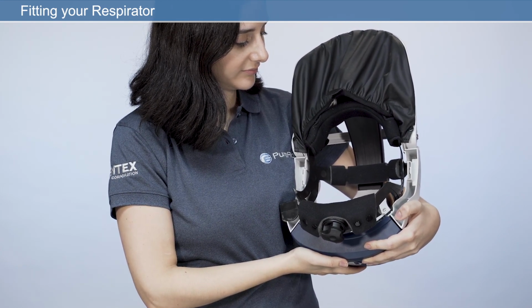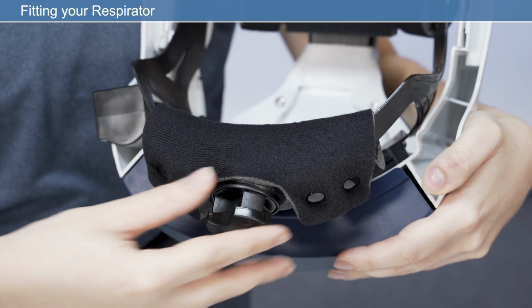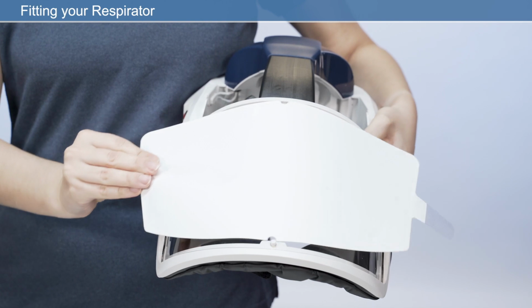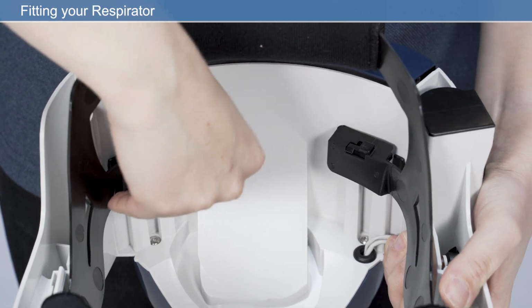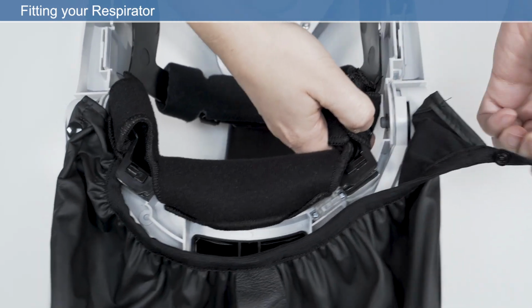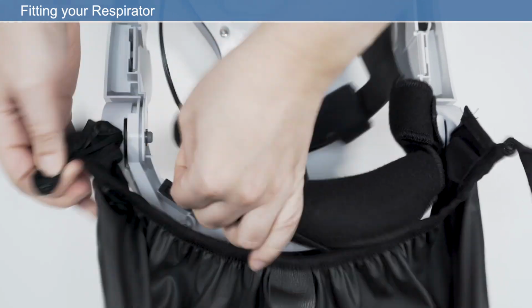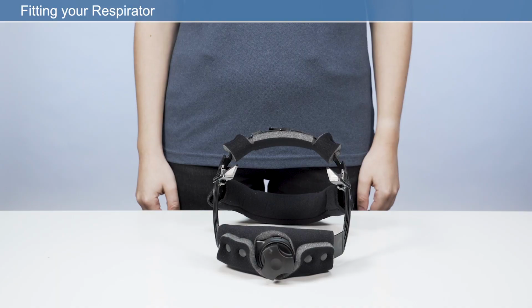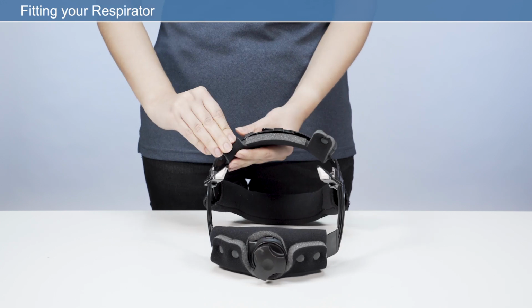To do this, we will carry out the following checks: crown strap adjustment, headband adjustment, face seal fitting, and visor overlay fitting. To adjust the crown strap for optimal height, release the headband mounts from the 4 attachment posts in the respirator frame by pressing the release clip. Unfasten and remove the crown pad to access the adjustment straps.